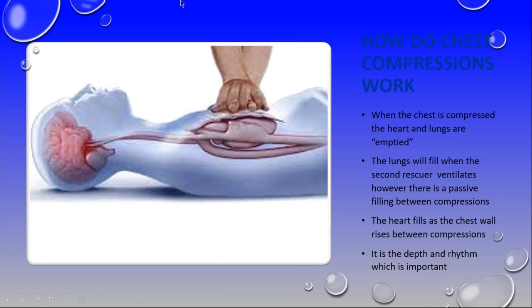1, 2, 3, breathe. 1, 2, 3, breathe. 30 seconds. Assess. Let's go. 1, 2, 3, breathe. Now, the person can say, what is the saturations? What is the glucose? What is happening?